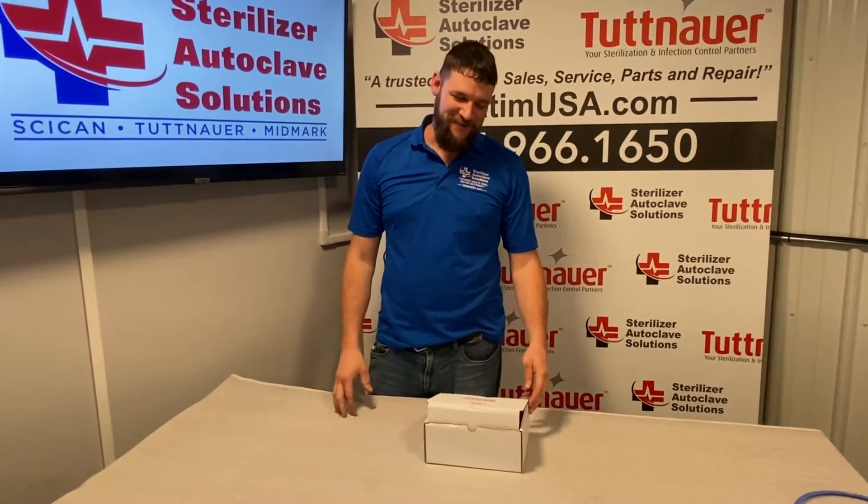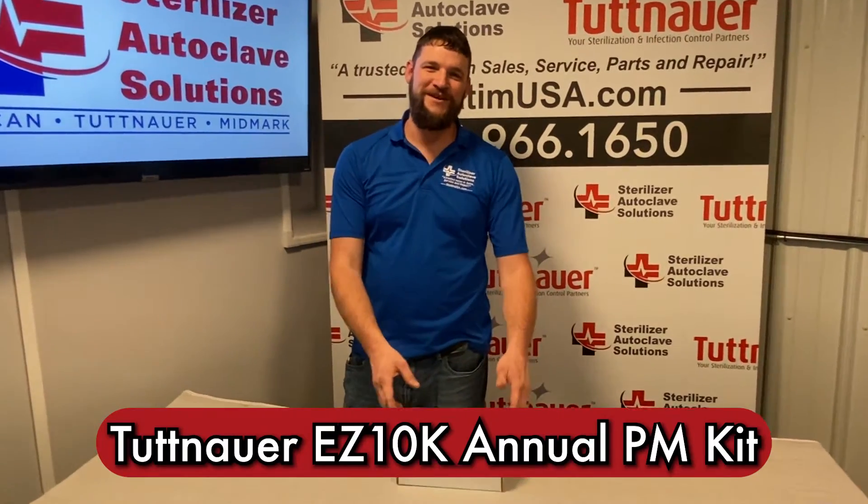Hi, this is Ian with Sterilizer Autoclave Solutions. Today we're going to be going over the annual preventative maintenance kit for the EZ10K.